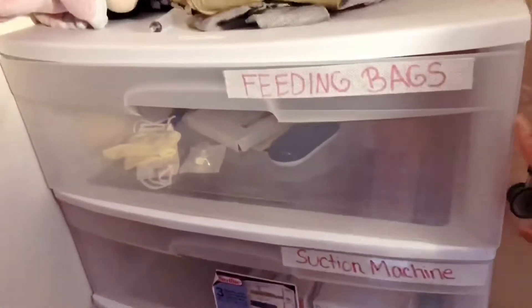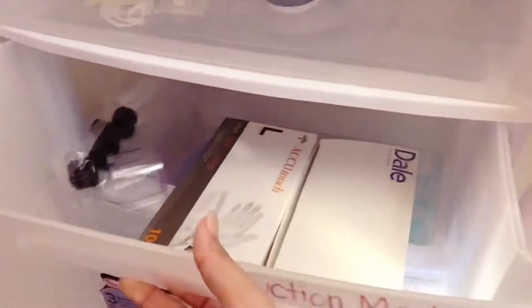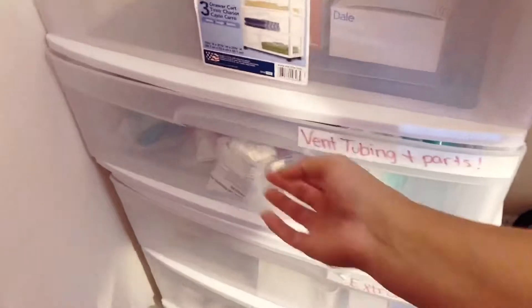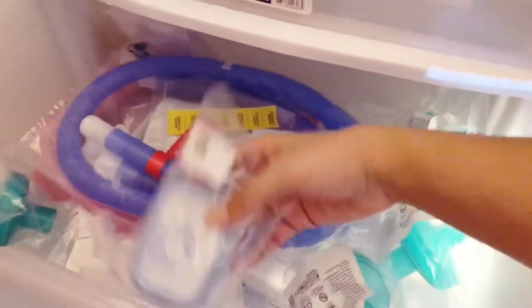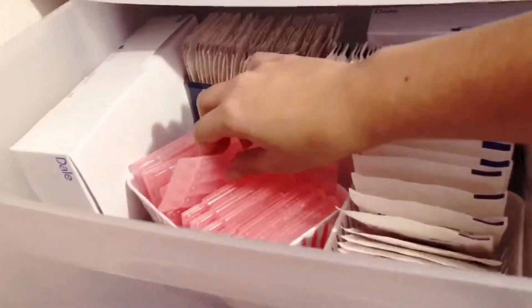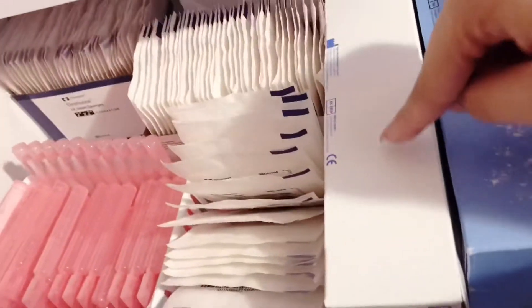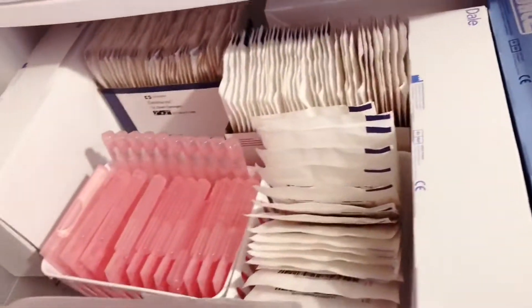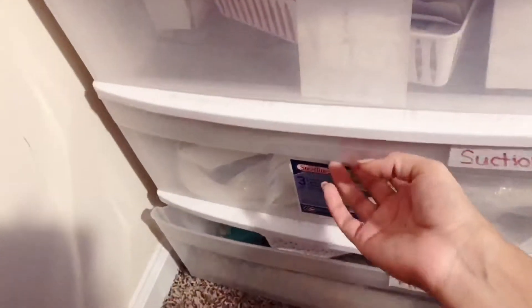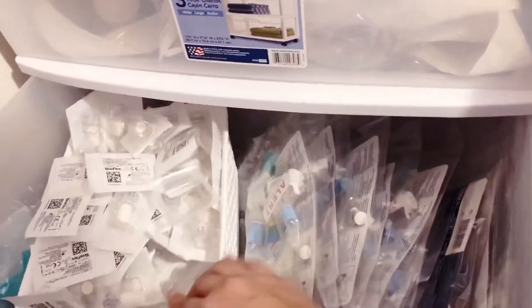The first drawer is for feeding bags — there's nothing in there right now. Then there's vent tubing and parts — the tubing and the omni flexors we need for the trach. Then we have saline bullets for whenever her trach is dry, extra trach ties, and the two-by-two split gauze which is what we put under her trach every day. And then one drawer is just for suction caps.